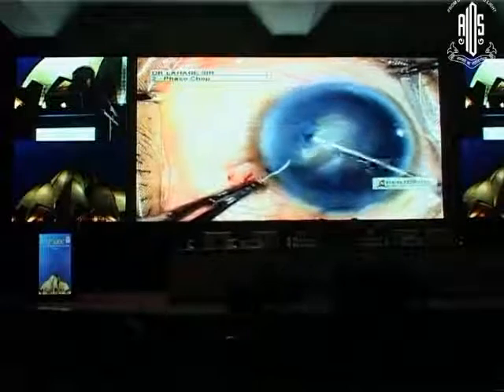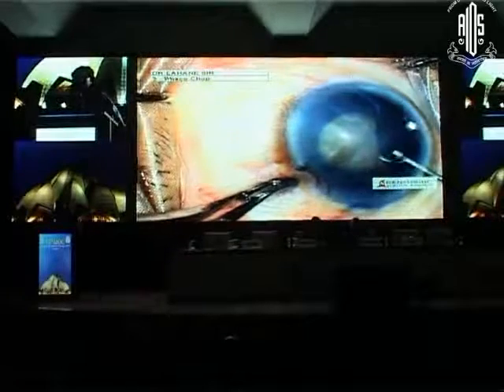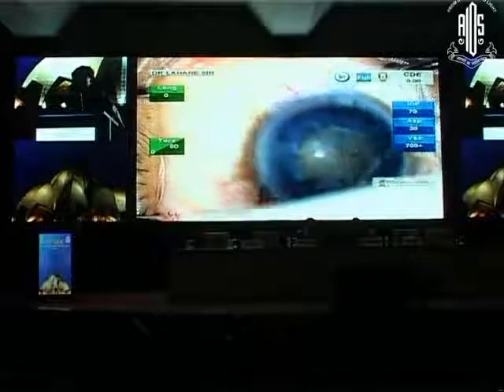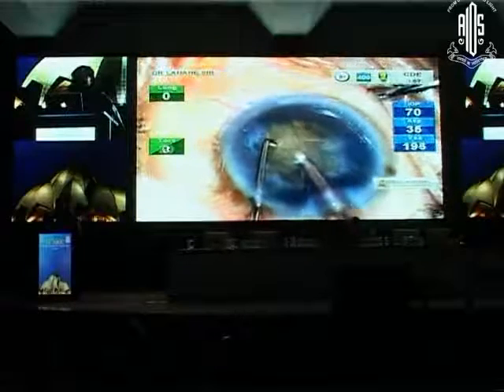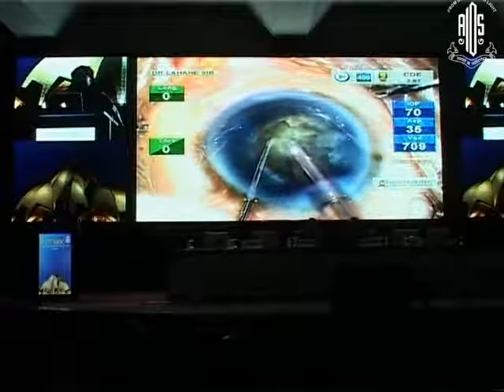Blurex is used, as you can see, because the cataract is appearing to be white, but inside the nucleus is hard. Blurex helps us to make a complete capsulorhexis in cases where there is no contrast, in case of mature cataracts. A very, very diligent hydro is made because the nucleus is hard and the PC can be thin. Superficial cortex is emulsified so that there is access into the substance of the nucleus. You can see carefully that the nucleus is embedded by the phaco tip.